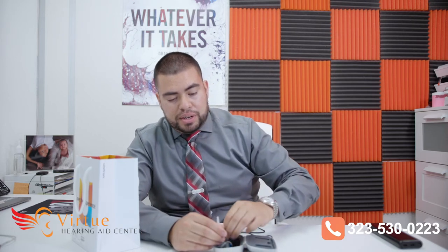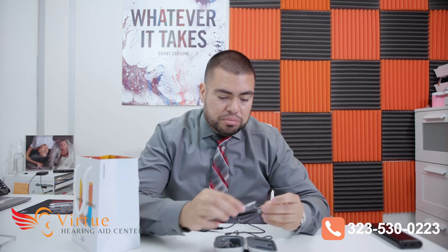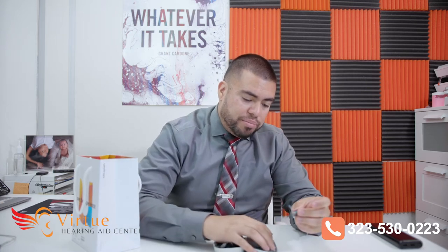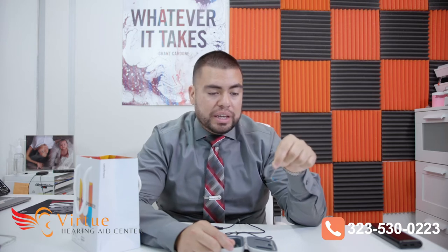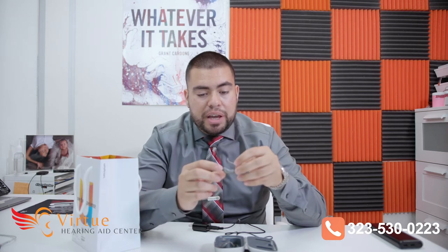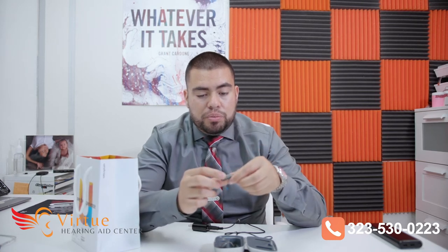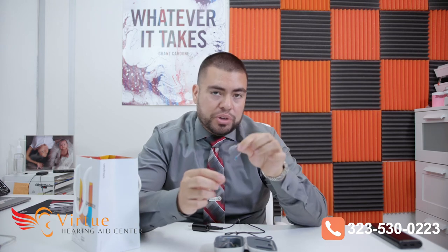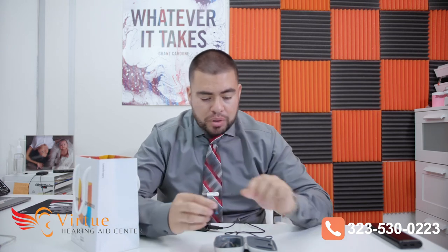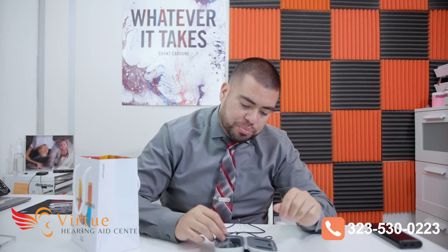Inside the case also comes a little cleaning brush. I'm going to take one of the hearing aids out now just to show you — it's a cleaning tool to brush them off. But more importantly, the actual unit itself. This is Unitron's smallest rechargeable hearing aid. It is 100% fully rechargeable with a lithium ion battery, so it's only rechargeable — you can't put any disposable batteries in this. To charge them, you simply just put them in the case.